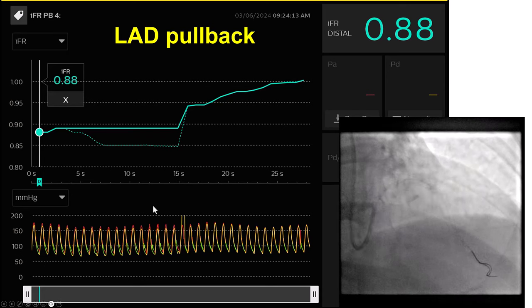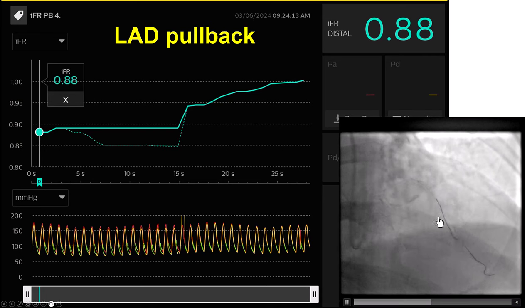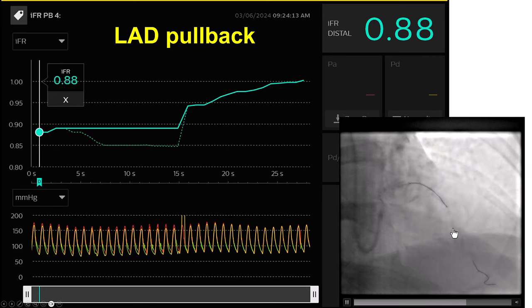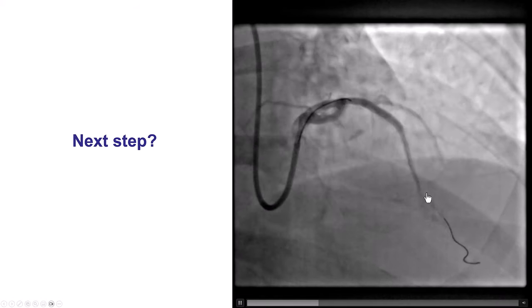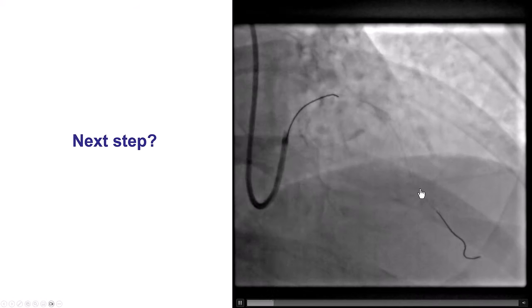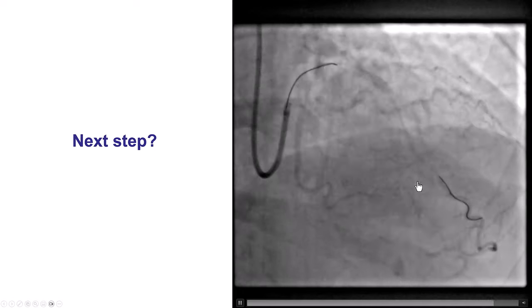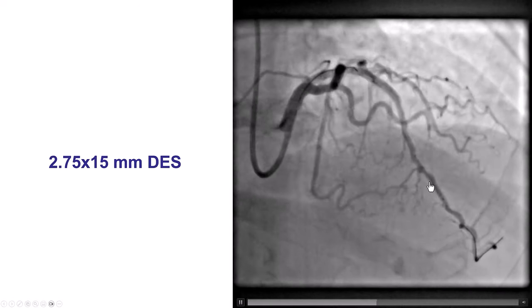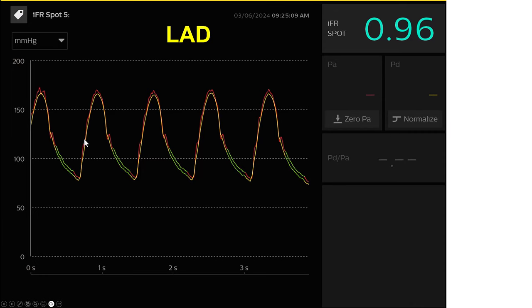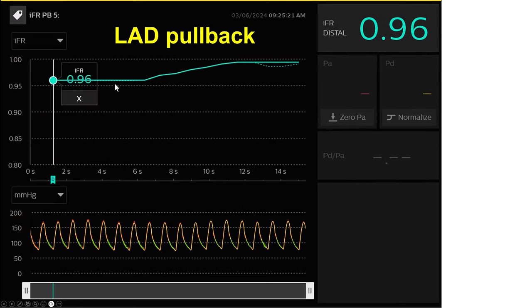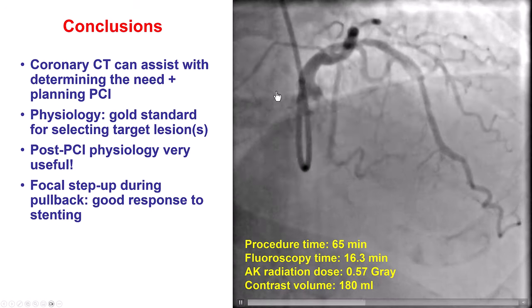On pullback, we found a remaining step-up corresponding to an area of tortuosity distally — right next to the septal branch — indicating the patient was still ischemic. So we decided to stent that area with a 2.75 by 15 mm drug-eluting stent, which provided a nice result. The final IFR in the LAD was 0.96, and on pullback we could see only minimal diffuse disease with no significant focal stenosis — a nice final result.